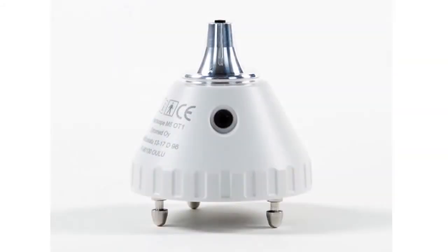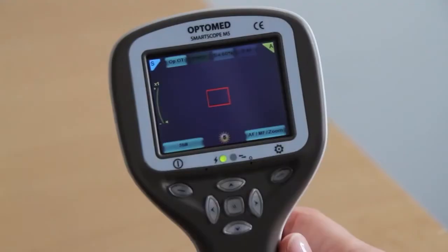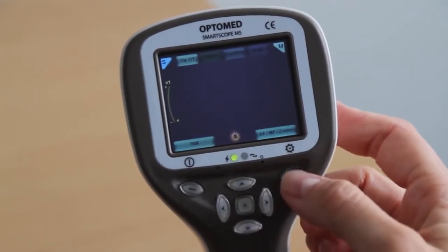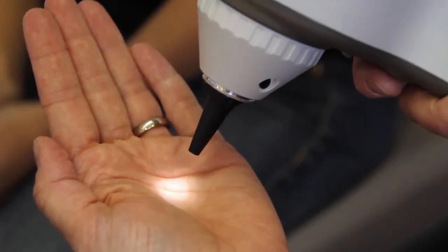Next, we will go through the steps of performing an otoscopic examination to ensure optimal image quality with the Smartscope OT1. To ensure the camera is stable for imaging, it is recommended that both the patient and examiner are seated. Select the preferred focus mode by pressing the right soft key. It is recommended to use autofocus. Turn the light on by pressing the shutter halfway down.